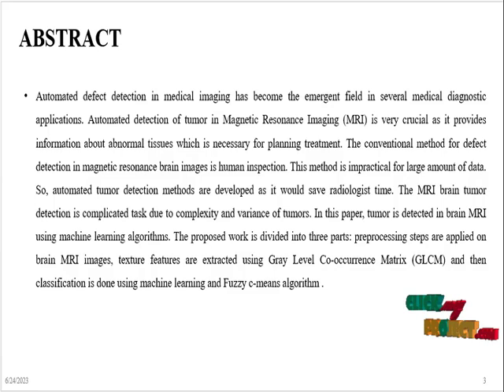Now we are going to discuss brain tumor detection based on machine learning algorithms. Abstract: automated defect detection in medical imaging has become an emergent field in several medical diagnostic applications. Automated detection of tumor in magnetic resonance imaging is very crucial as it provides information about abnormal tissue, which is necessary for planning the treatment.